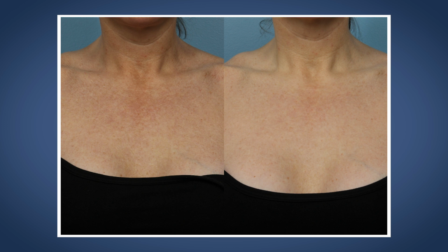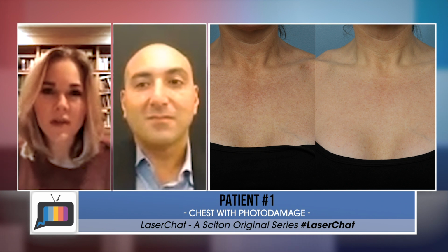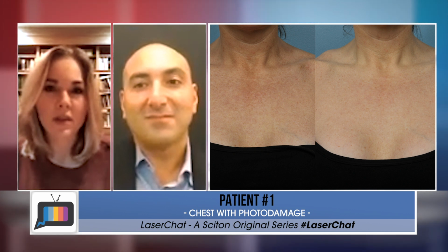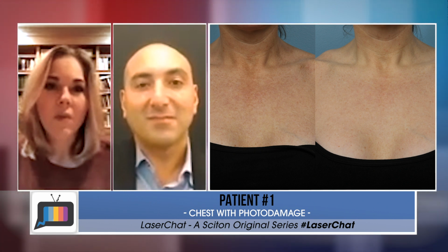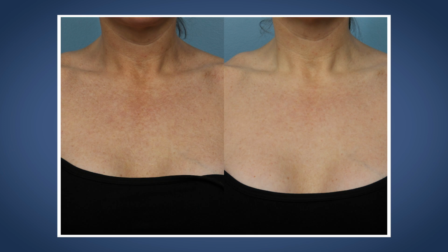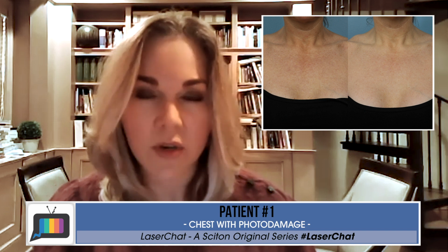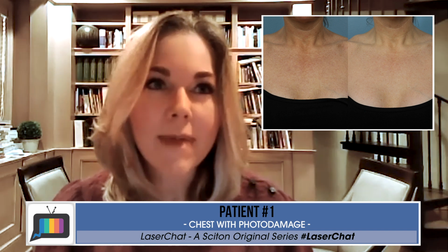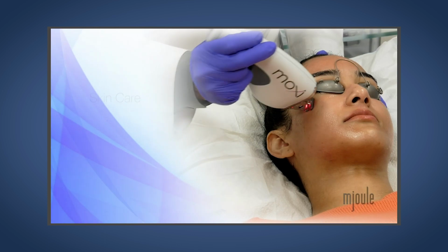So again, she had some dyspigmentation. It was hard to see in the photos, but she had some tiny cherry angioma. And again, that kind of rough and bumpy skin. So the first thing was a BBL treatment. And she had a HERO treatment, the high energy rapid output device, which is great for non-facial areas because you can put in a lot of energy without worrying about the stamping phenomenon. And I find it more comfortable than the previous stamping technique, at least on the body. We do it without anesthesia. And then we delivered a MOXI treatment, a 1927 nanometer wavelength, right on top of that to help with texture.